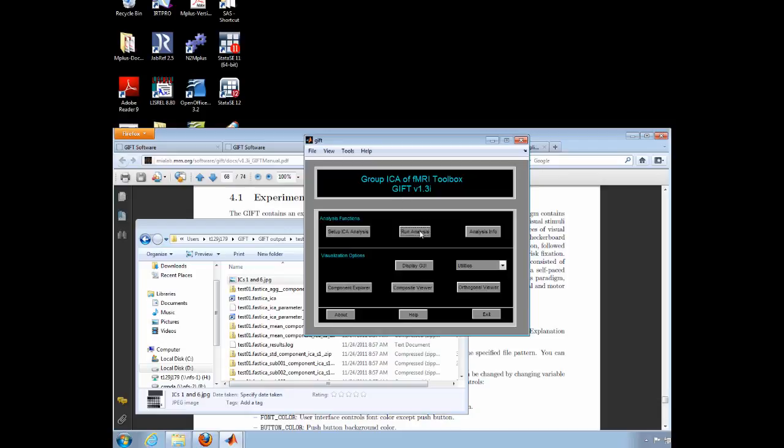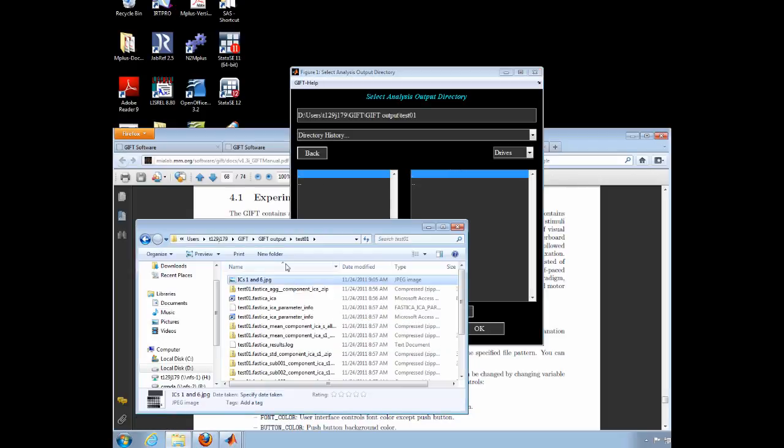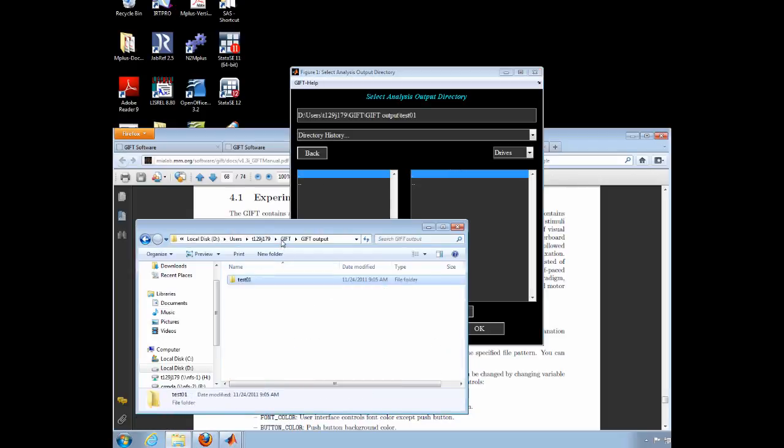Now we can create a second test folder for the next output using the InfoMax algorithm. Repeat the same steps from above, but specify the correct folder and algorithm.